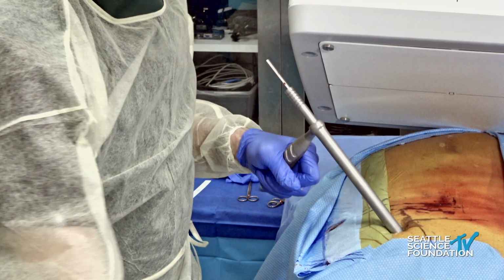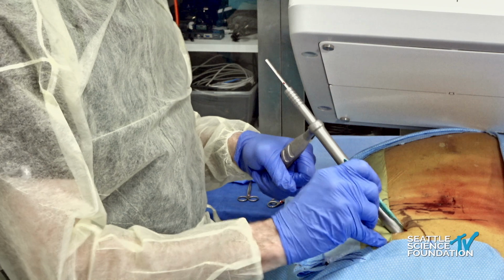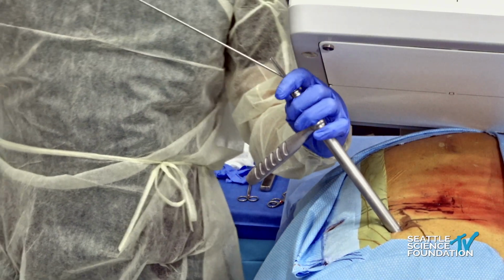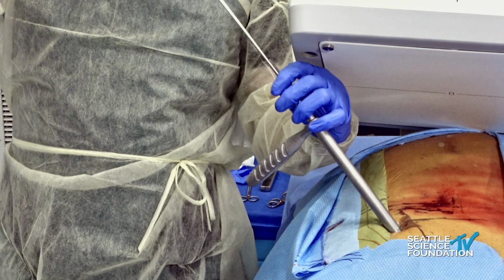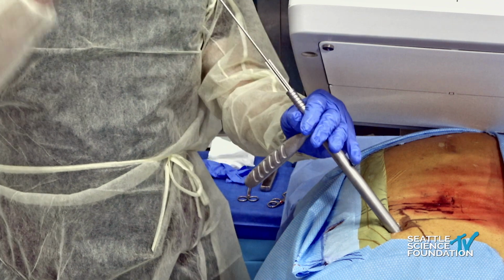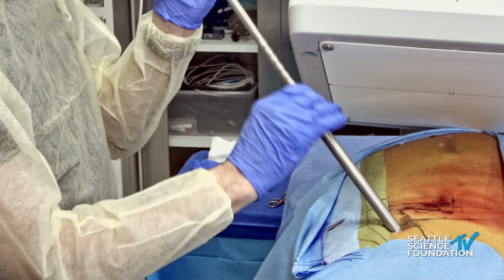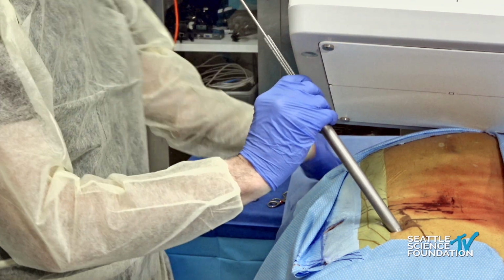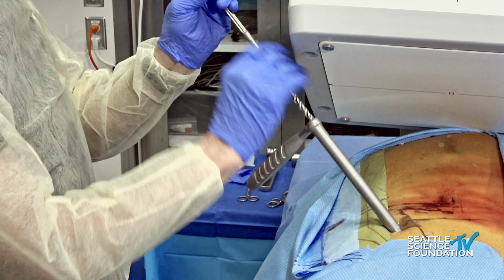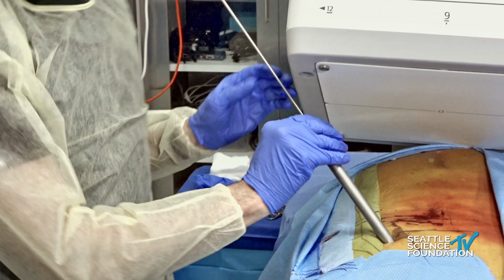That's designed to do that, just to make sure you're flush with bone. Okay, have these in. I'm going to put my extender on, and I'm going to try to skip the drilling portion of this just for sake of brevity, since we've seen that before, that 9.5 millimeter drill. Let's remove dilator 2, remove dilator 1, keeping in mind you still have to pin the Steinman pin so it doesn't come back on you.